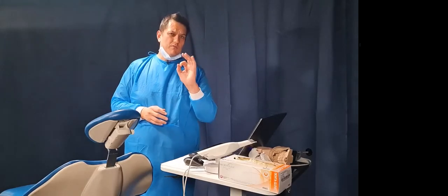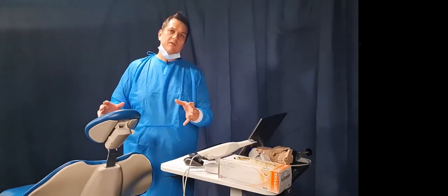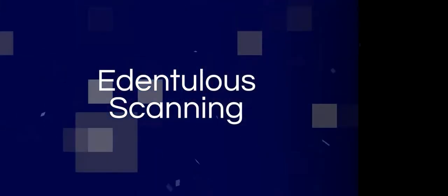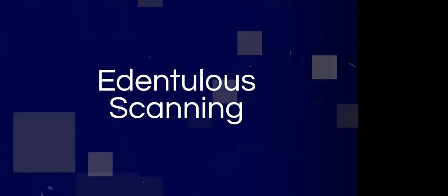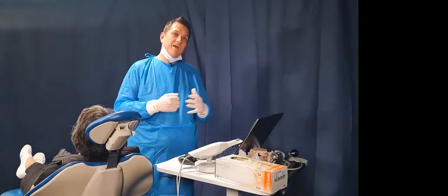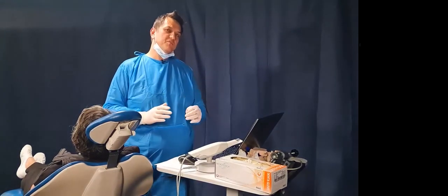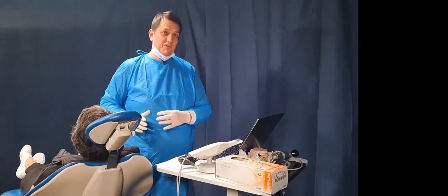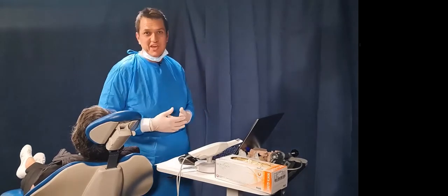Okay, now we've looked at a single partial tooth. Let's now look at a fully upper edentulous arch. We'll get our second patient to jump in the chair for us if we can. Okay, back with patient 2 now. Patient 2 presents with a full upper edentulous arch. Now, I've been very privileged to be able to get this patient in here because she's one of my households, so I can almost demask and communicate a bit better with you.